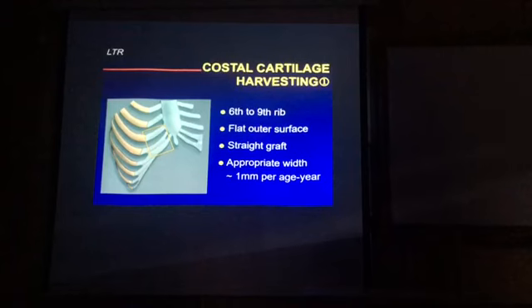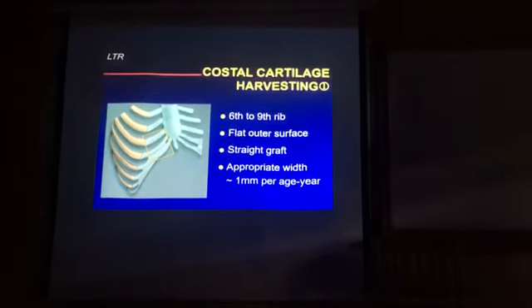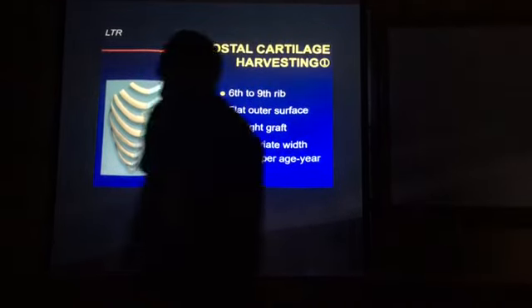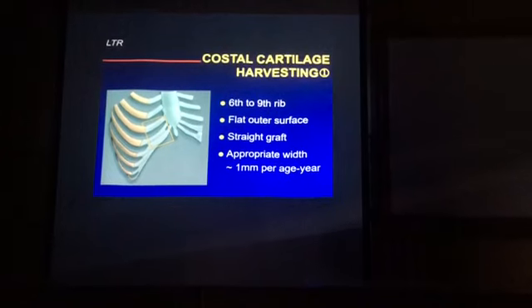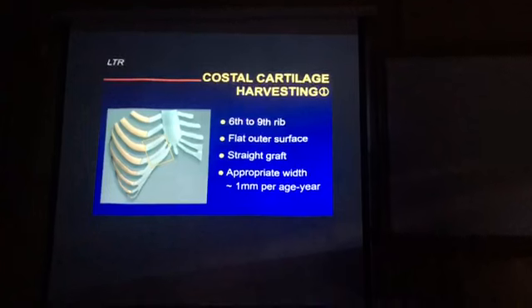In such a case, I have to fix the epiglottis again to the thyroid. When I open craniocaudally, you open completely like a book, and then you do your posterior cricoid split. You put your graft posteriorly, and then you put a graft anteriorly.